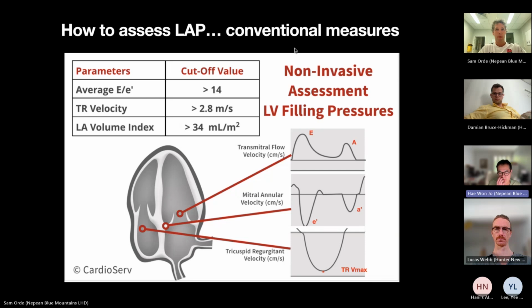Sorry, Sam, is there a reason you are talking specifically about left atrial pressure and not calling this diastolic function? Yeah, very much, because I'm not interested too much in diastolic dysfunction, I'll be honest. I report it a lot when we're doing outpatient echoes. What I'm interested in critically ill patients is, do they have a raised left atrial pressure or not?